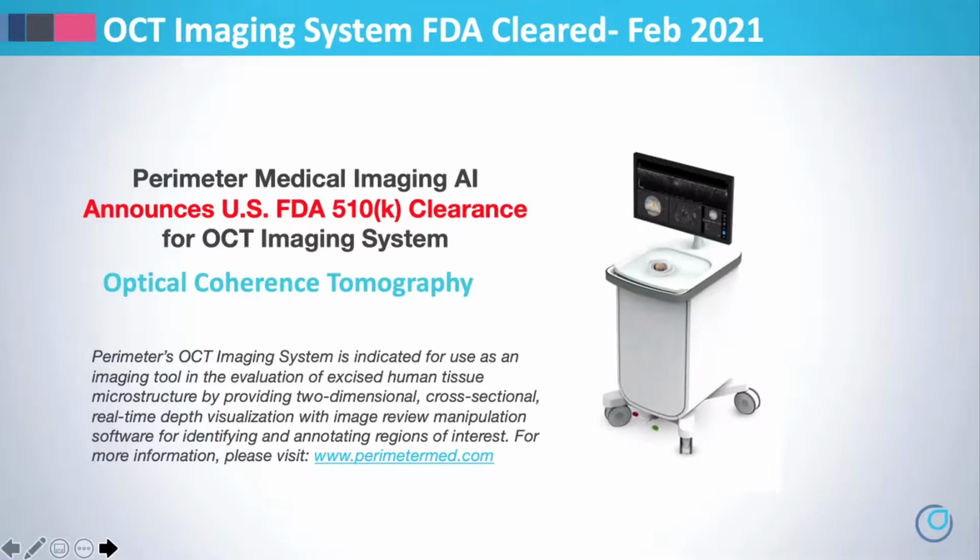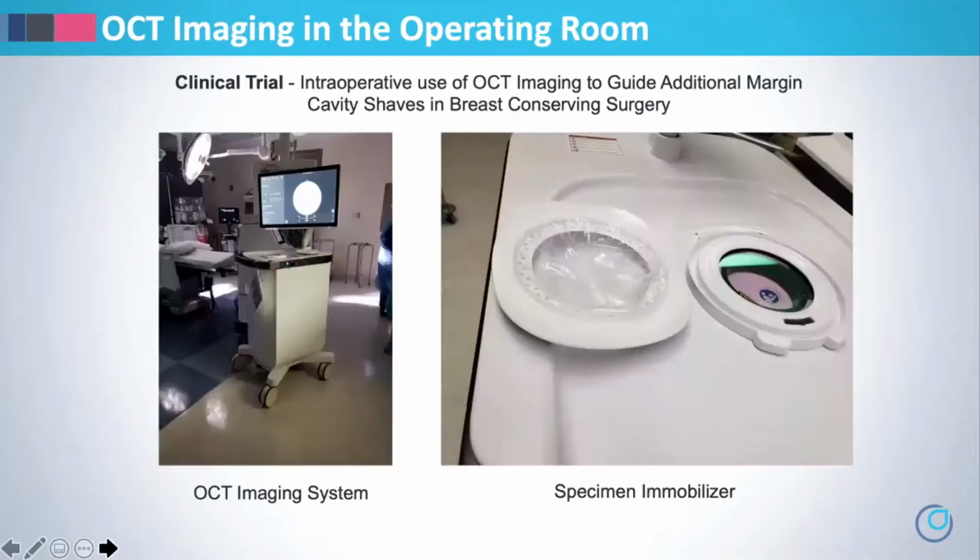And we are currently in the midst of an IRB cleared protocol for using OCT in the operating room to evaluate a patient's tissue specimen.